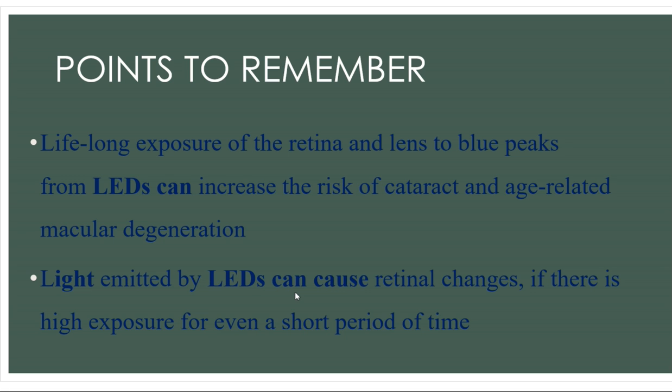A few disadvantages of using an LED light source: the lifelong exposure of the retina and lens. Exposure from what? Exposure from the blue peaks that are usually there in LEDs. It can increase the risk of cataract and age-related macular degeneration.